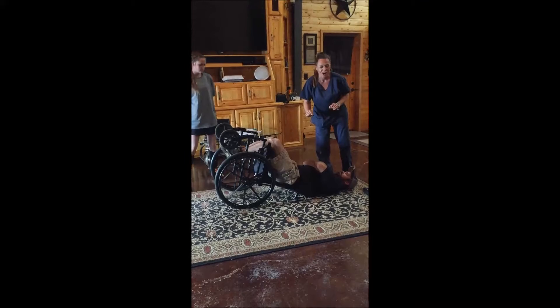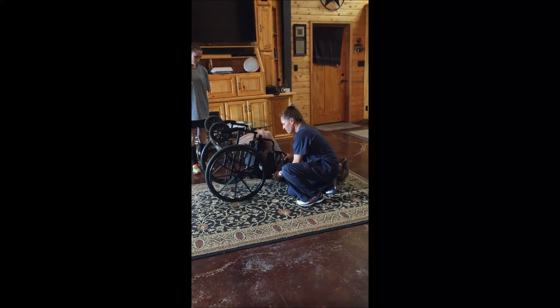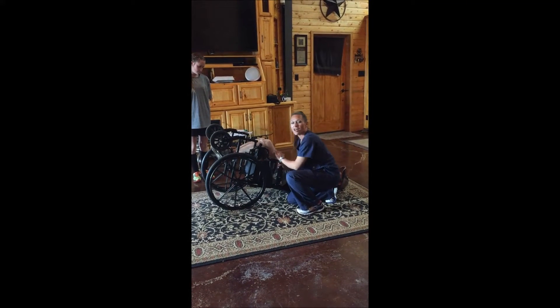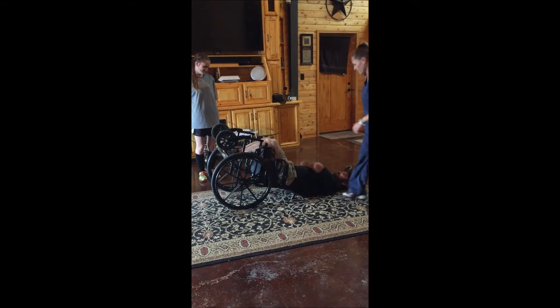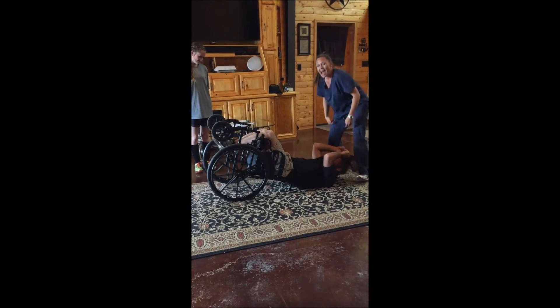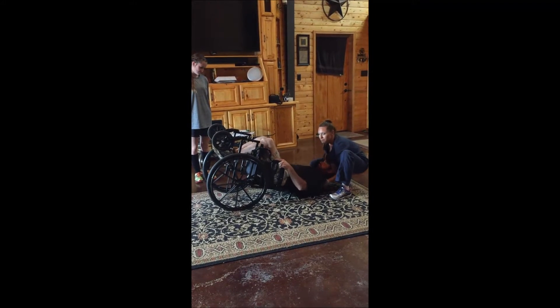put the armrest back on. Having the armrest on gives them something that they can hold onto. Ask them to hold onto the armrest and help you push them into the chair.